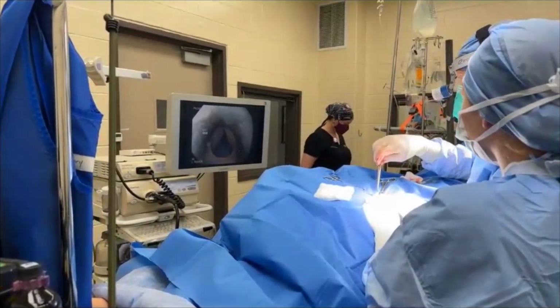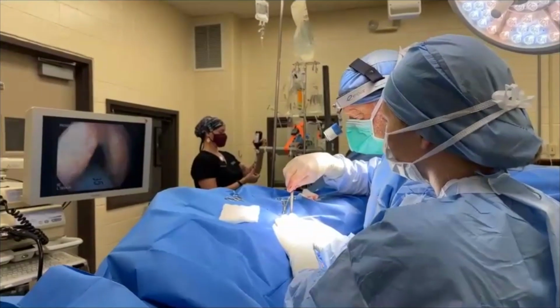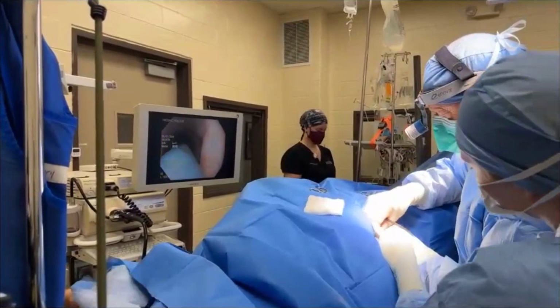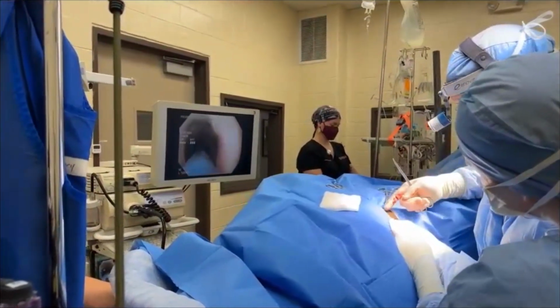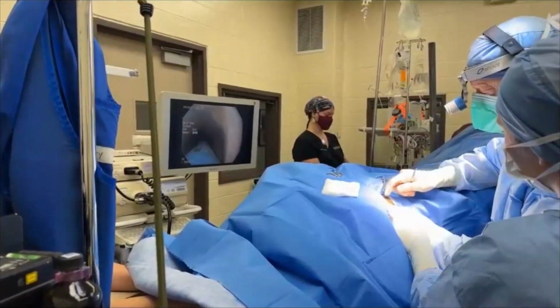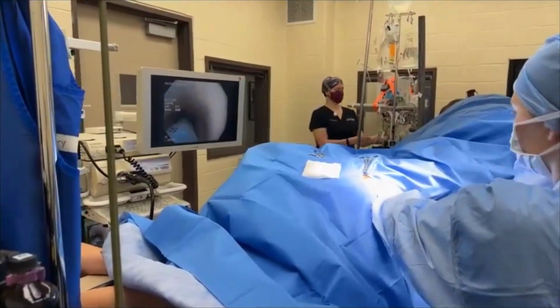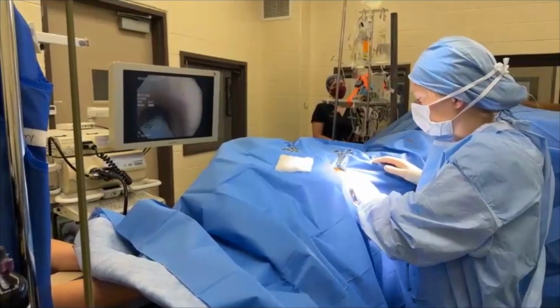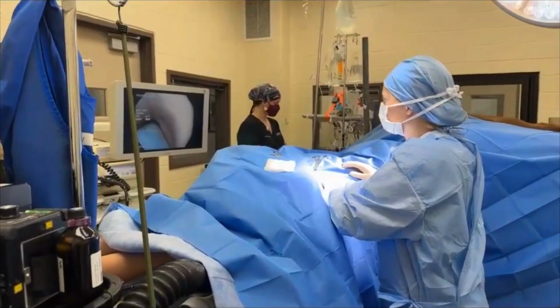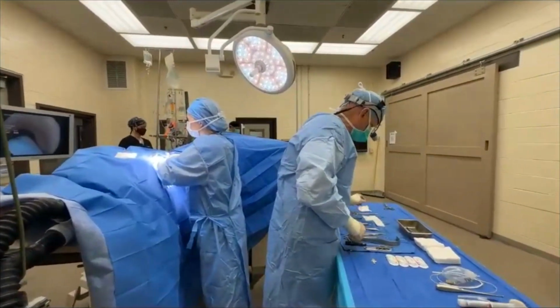So are you watching the monitor as you do this, and the surgical area? Mostly I'm focused on the surgery site, but there are a couple of things we're scoping for. When we're putting sutures around the cartilage, we want to make sure we don't penetrate into the airway because the airway is contaminated. So we're watching to make sure we didn't inadvertently stick a needle through that mucosa into the airway. That's the important part of where the scope is now. It's in the trachea, so we can make sure nothing penetrates into the airway.